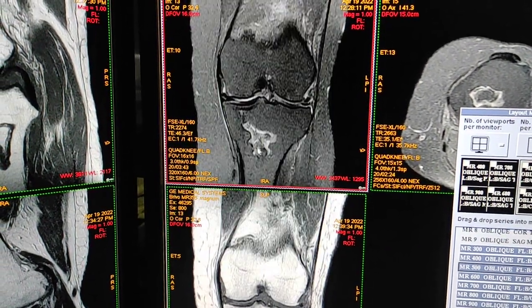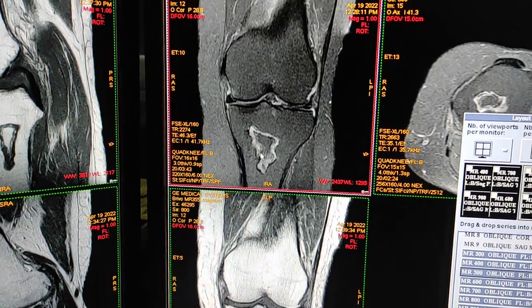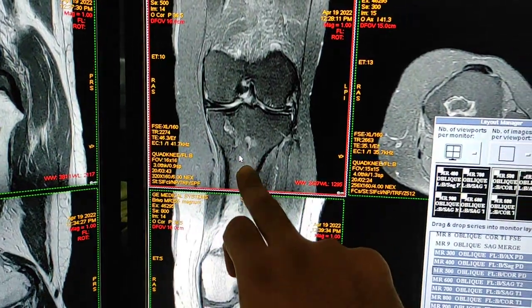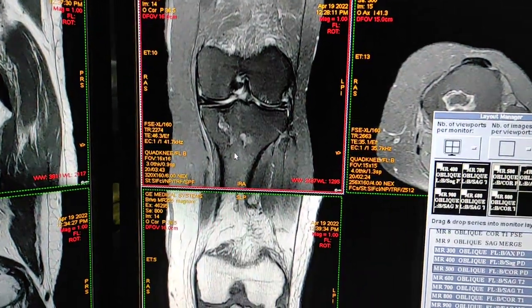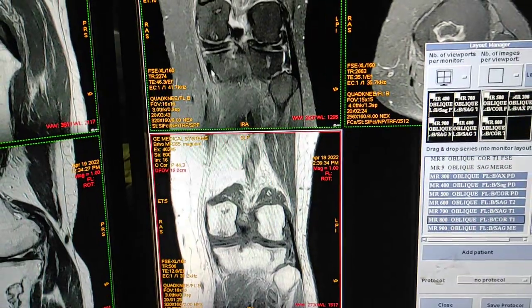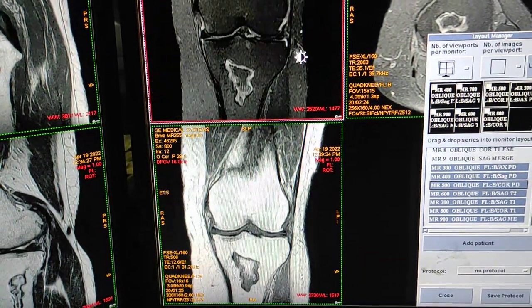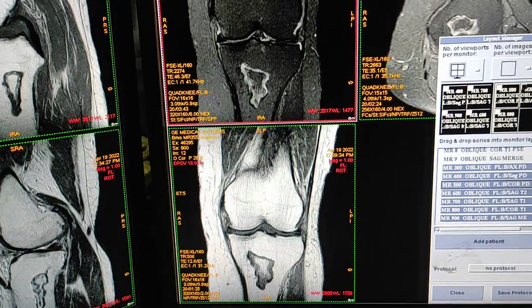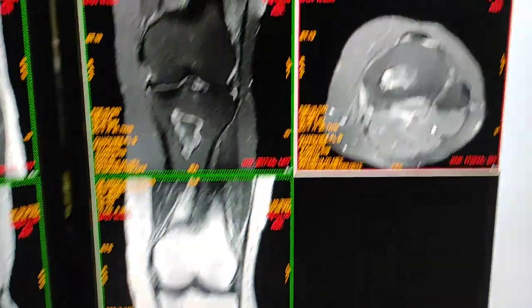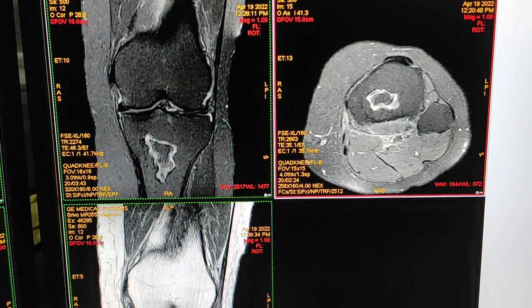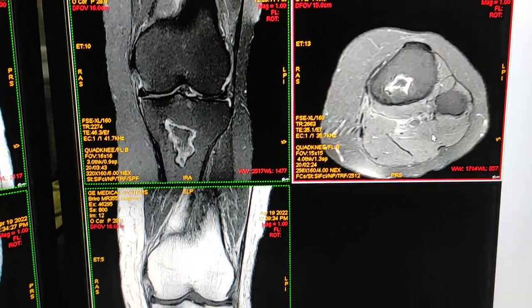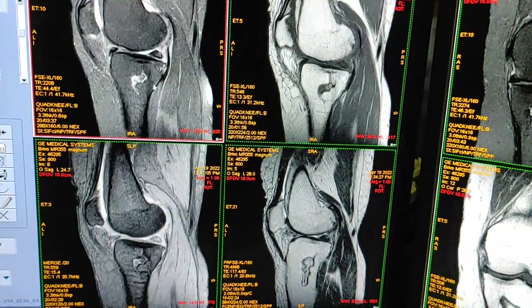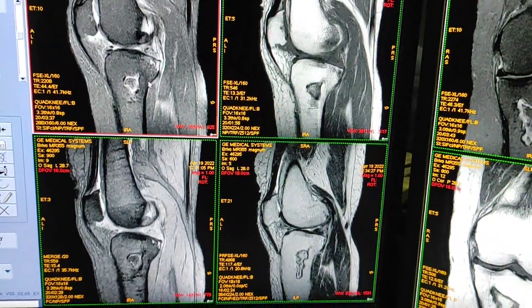In the coronal view, I will show you: this is fat-sat PD — this is tibia, this is fibula. The lesion is in the upper tibial shaft and extending medially. You can see the same on fat-sat PD coronal and T1 weighted. From this type of picture you can confirm this is bone infarct.